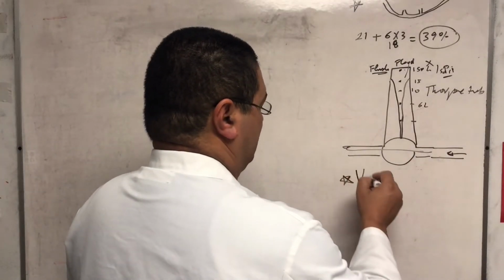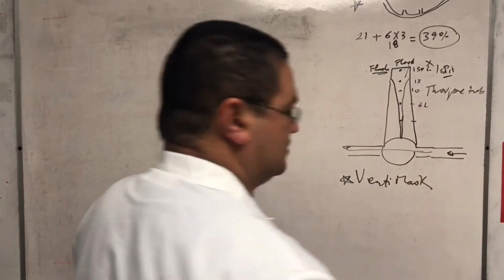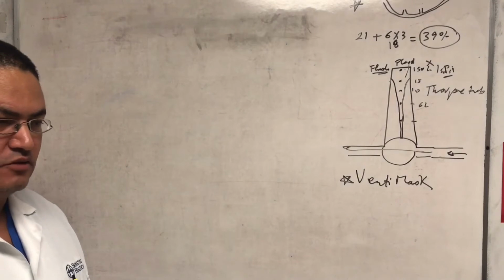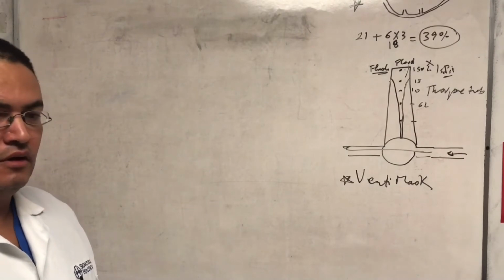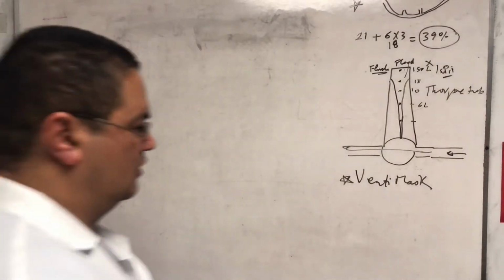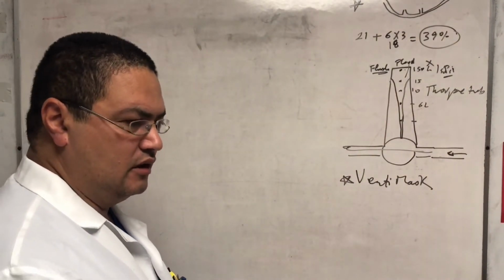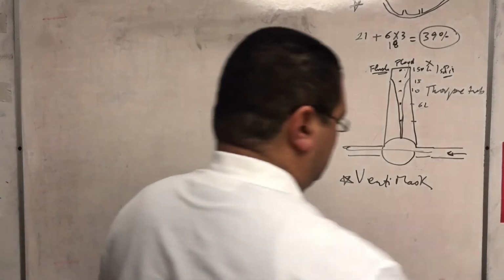Next, we're going to talk about the venti mask. And the venti mask is the biggest scam in medicine. The idea of the venti mask, using the Bernoulli principle, which is the jet principle, basically, it's a great idea for the lab, but not for the patient. So this is the idea. The venti mask comes with 4 or 5 adapters. Each one has a different size, different color, and each color gives you an FiO2. So this color gives you 40%, this one, all the way to 80%.